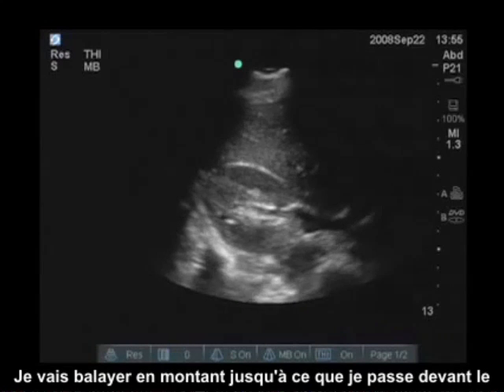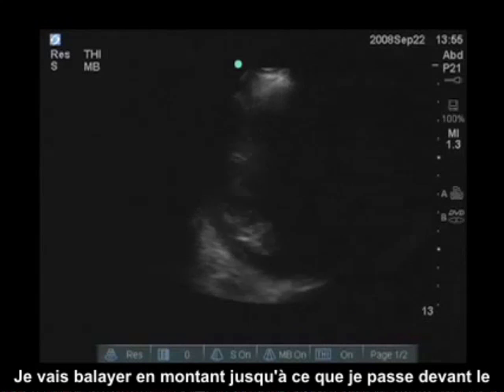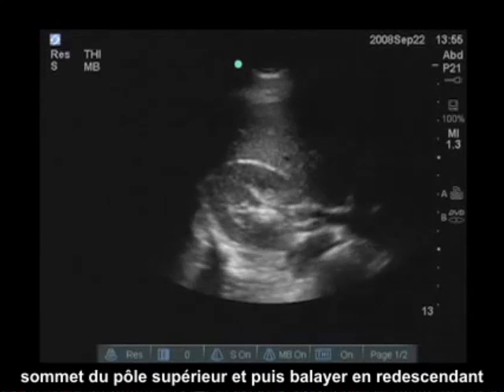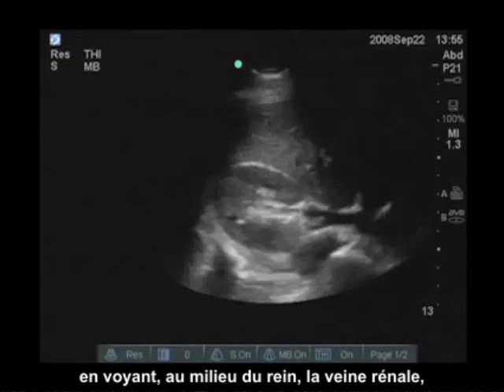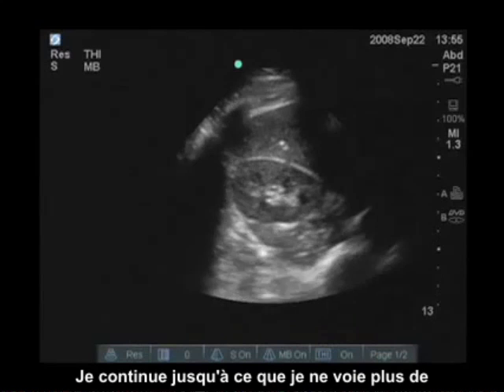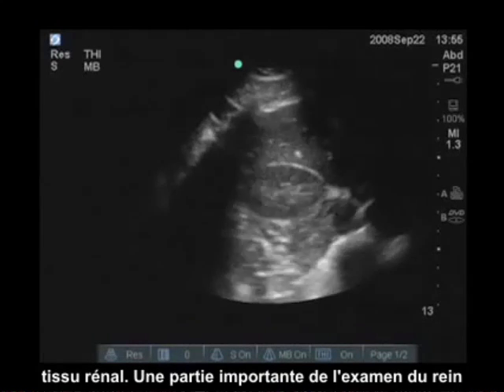I'm going to sweep superiorly until I move past the superior aspect of the upper pole, and then sweep back down inferiorly, seeing the mid-level of the kidney, the renal vein, moving down a rib space and into the inferior pole of the kidney. And I continue until I do not see any tissue of the kidney anymore.